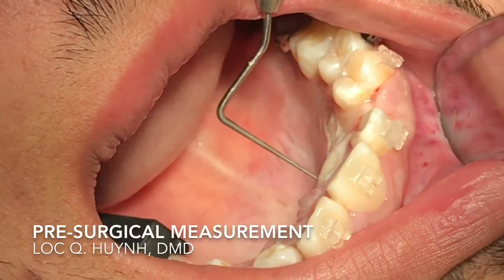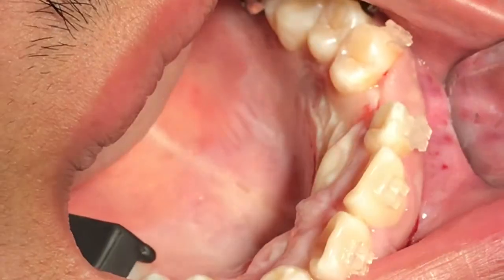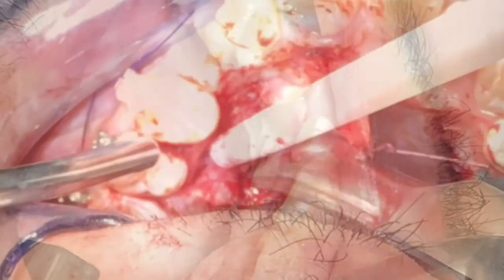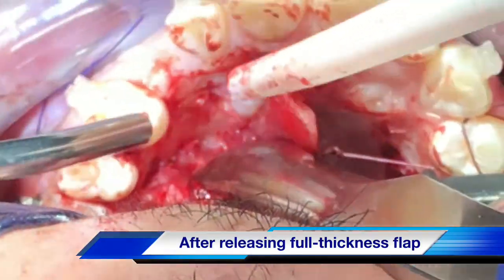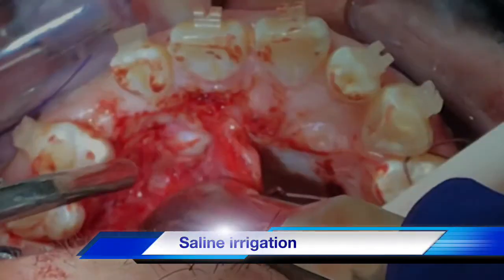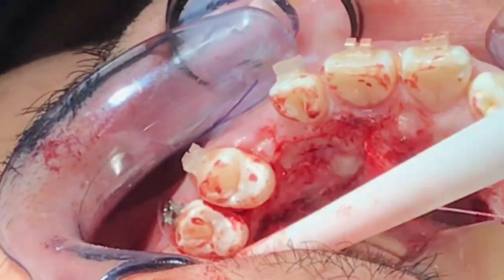With the 3D imaging, we review the dimensions of the impacted canine and where to start the surgery to expose it. Using this data, we can easily locate the area of the canine. In this case, the canine is located on the palatal side of the patient.